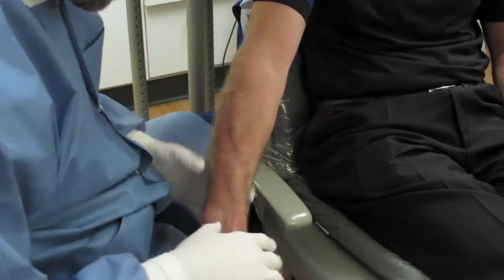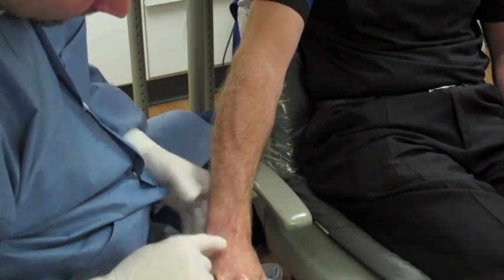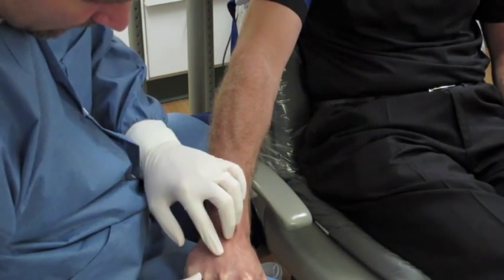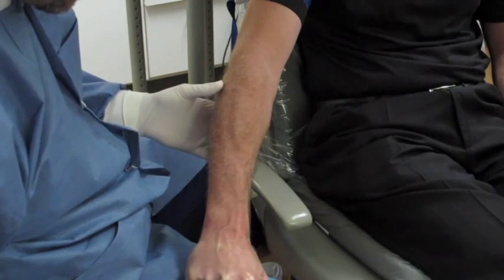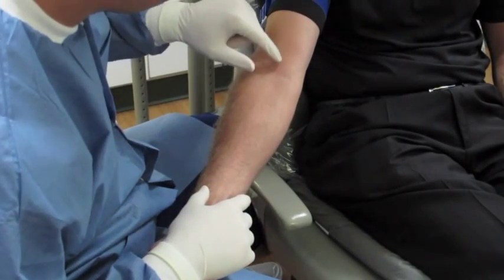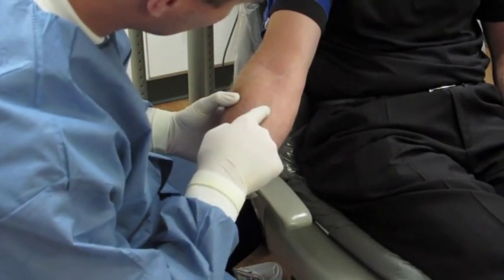You can see those veins, then look down the arm on the radial side at the cephalic veins, and then down in the dorsum of the hand, where there are often some veins that work nicely for dentistry, as you don't have to worry about the elbow bending during treatment. Where there's a bifurcation of the vein is a nice place to insert your needle so it won't move.